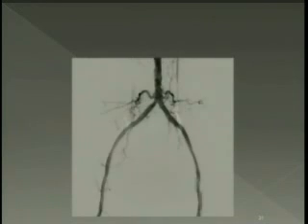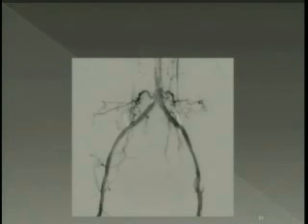Fairly simple steps again. Stent in location, post-dilated, and a good result. So in short, we had bilateral iliacs and bilateral carotids done on this gentleman. It was the longest procedure, but as I told you, we had reasons to do it in one go in this particular case. Would anybody have done it differently, or any comments?